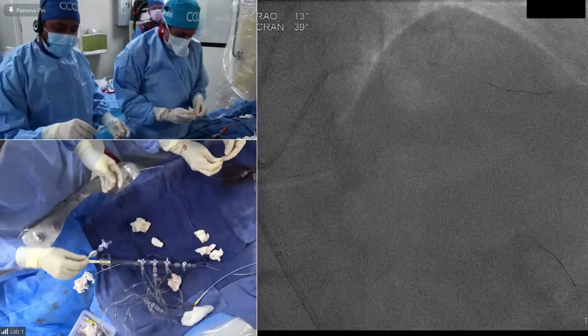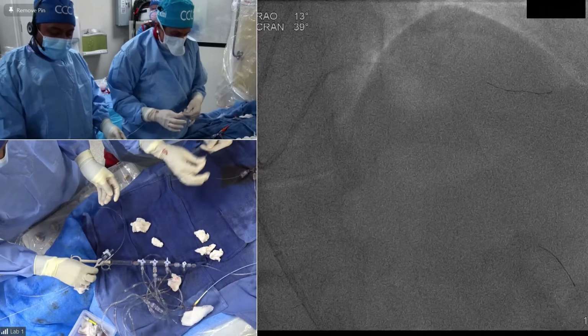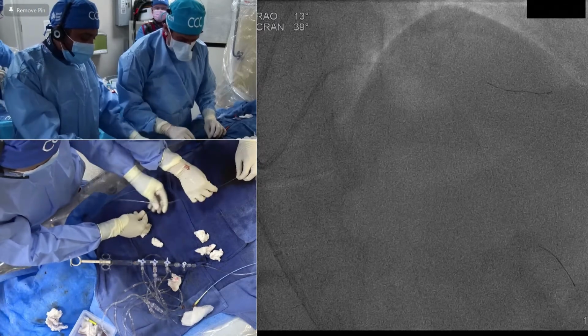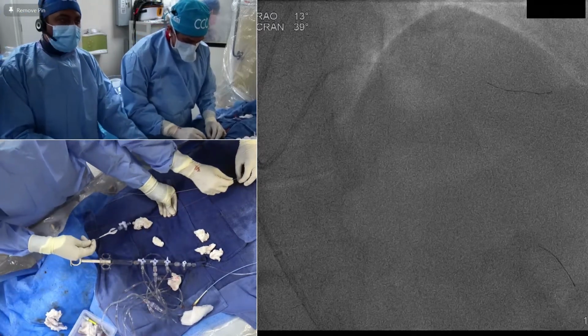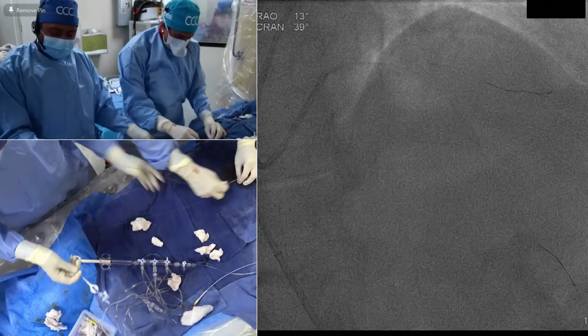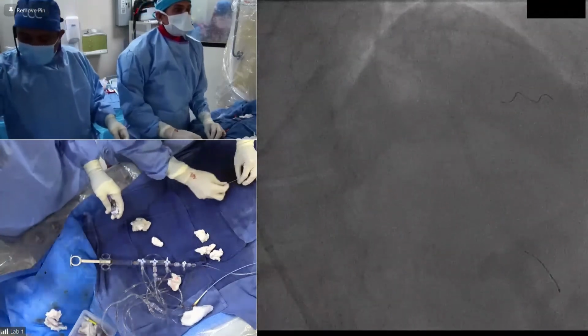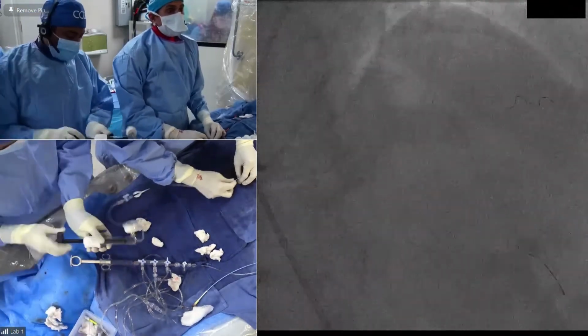Is the app playing by the side? No, nothing playing. Let's play up the app, please. You've got to show the app on the side screen. Oh yes, we do see it. Yes, that's right. Keep playing that. Keep looping it. We see the 3D app. Yep, that's right. The 3D app is shown. Excellent. If only it really was like that.